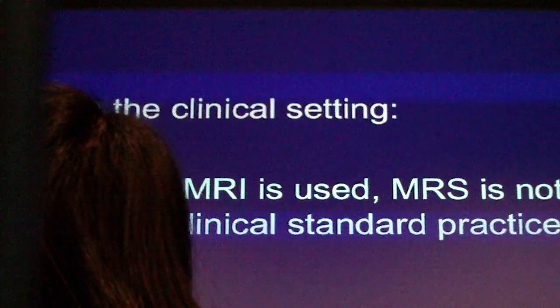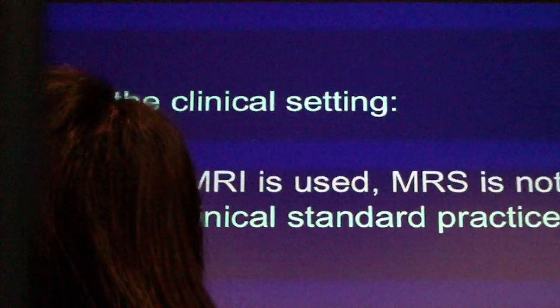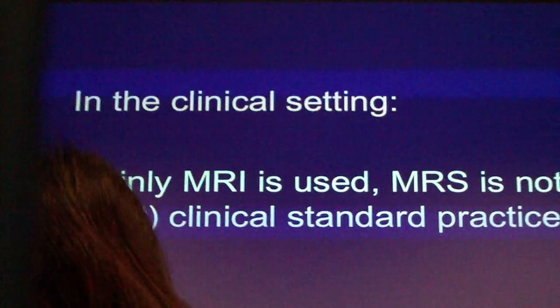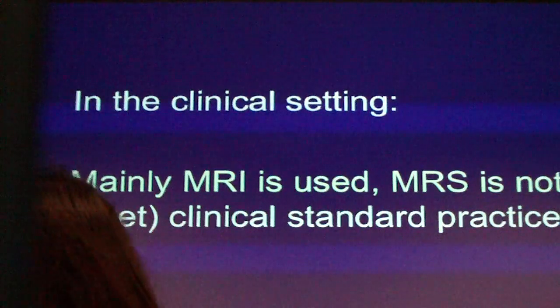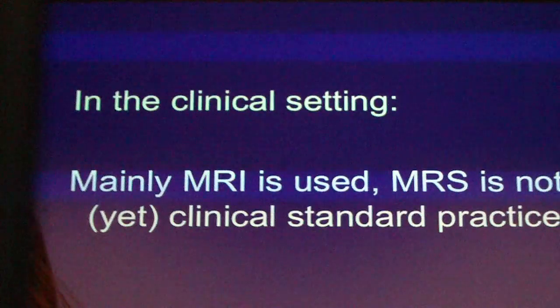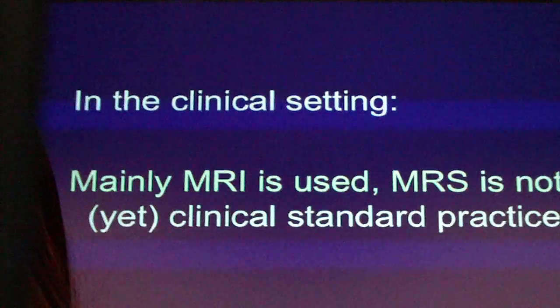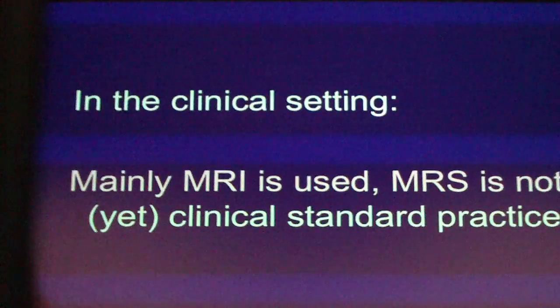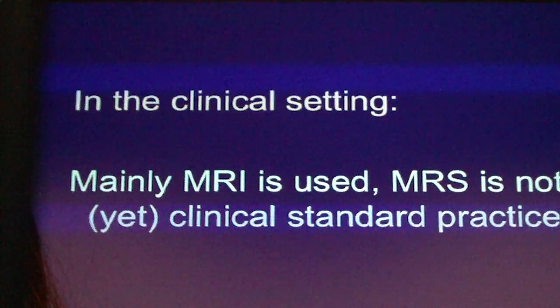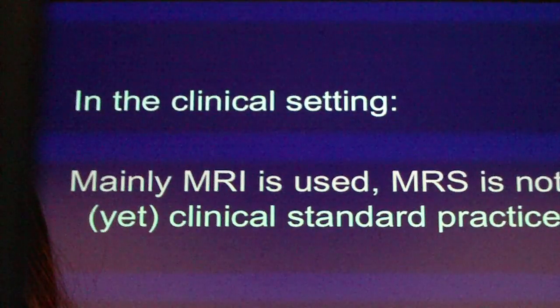And for the relaxation mechanisms, we have two, T1 and T2 relaxation. If we choose the protocol in the right way, we can maximize one versus the other component. And we can also use contrast agents, like gadolinium-based agents, that shorten the T1, and so make the blood bright in T1-weighted images, which is very important.